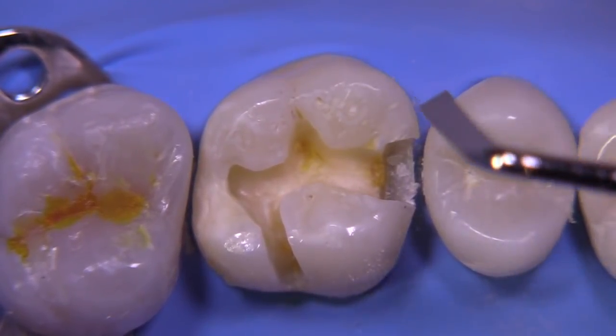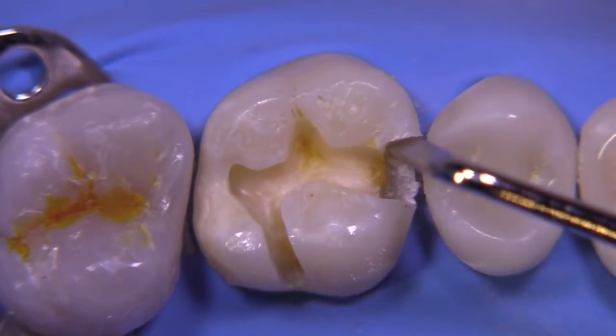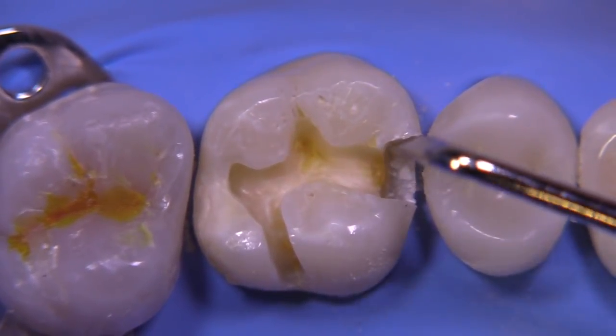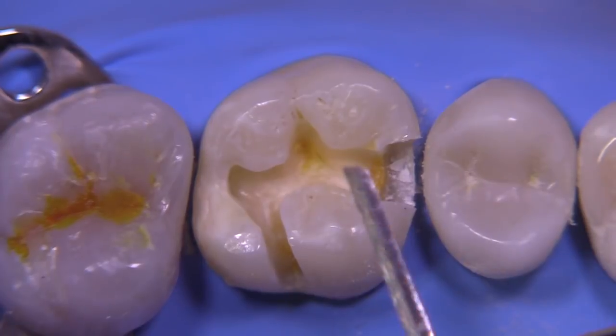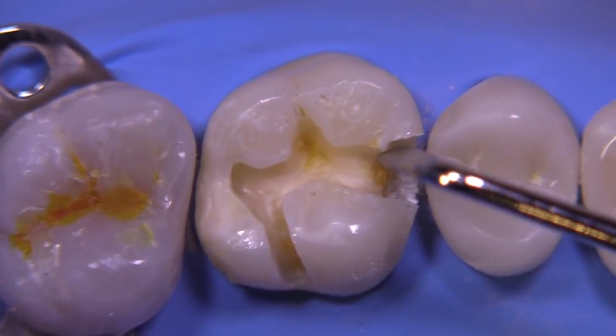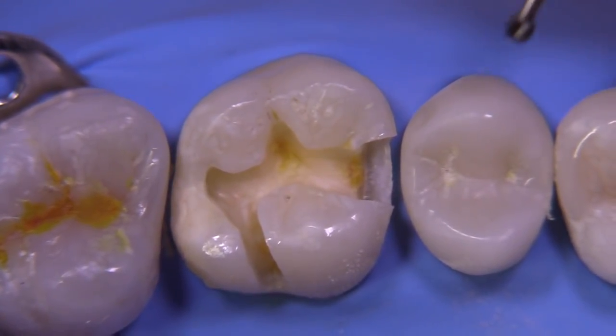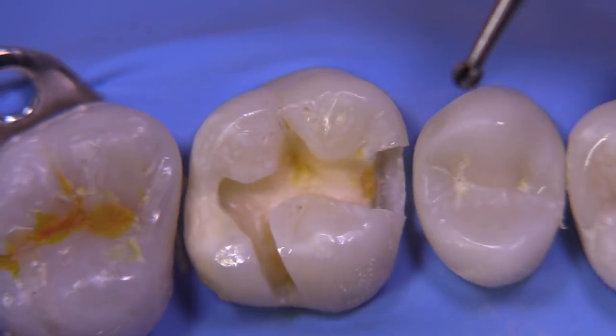We're going to do the same thing on the facial side using the sharp end of the instrument. The cutting edge is going to be up against that area and the bevel will be facing away from the wall. We're just trying to remove a little bit of loose enamel rods so we can get a preparation that looks a little bit cleaner in the box area.